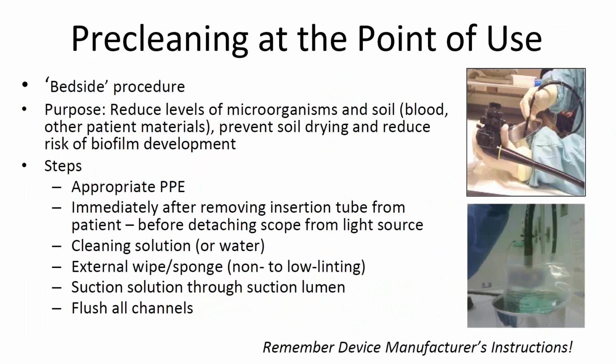And the purpose of pre-cleaning is to reduce that level of bioburden, whether that be patient debris or soil and microorganisms that are on the endoscope, to reduce the risk of biofilm development. Pre-cleaning is required each time the endoscope is used, and it should be done immediately, again, after removal from the patient. We need to wear proper PPE, and PPE is discussed in great detail in ST91.